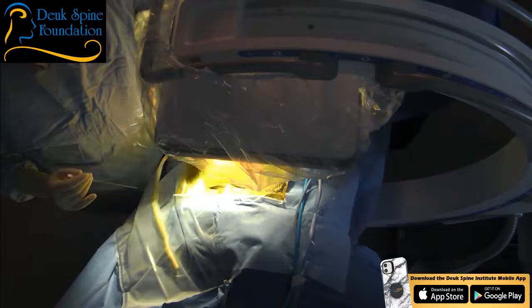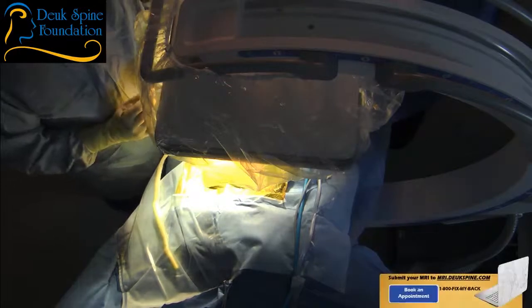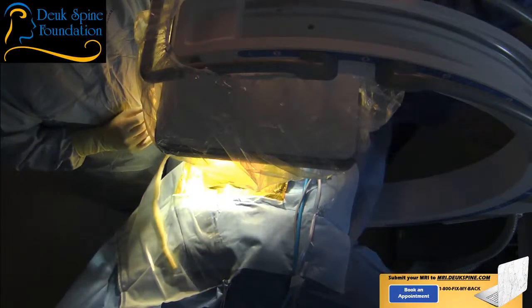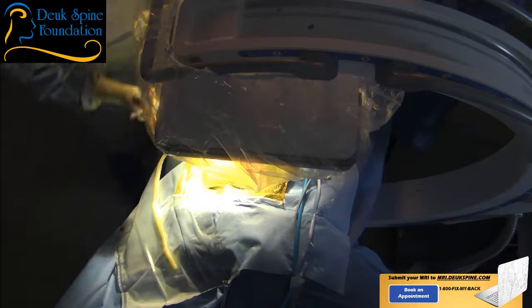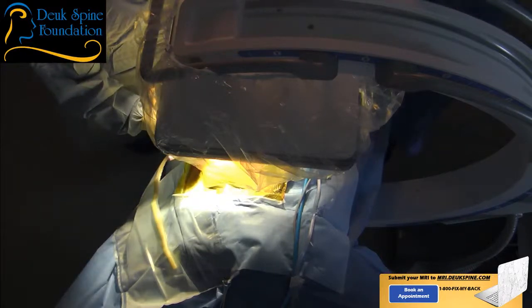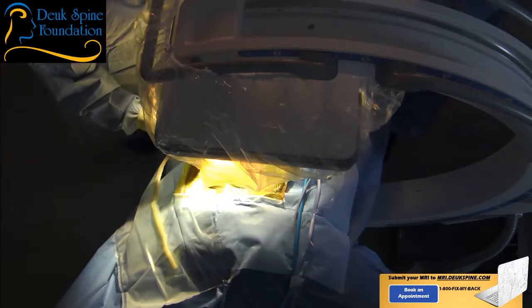All right, so we have to use an x-ray machine to find the parts of the spine to fix during surgery. There's no other way. X-rays are always used, whether it's a CAT scan or an x-ray machine. CAT scans use x-rays, and they just reconstruct the x-ray images 3-dimensionally to give you a little bit better picture, but we don't need a CAT scan to do these types of surgery, but we do need an x-ray machine.